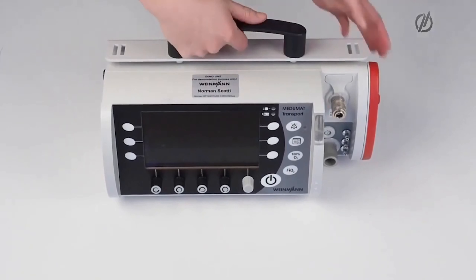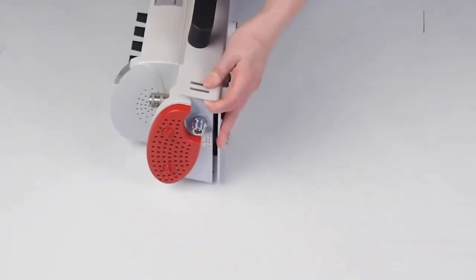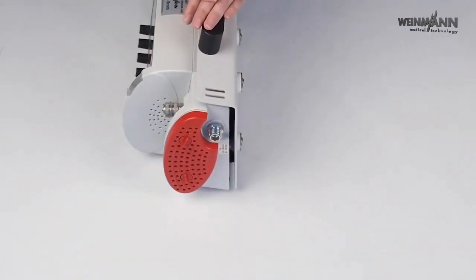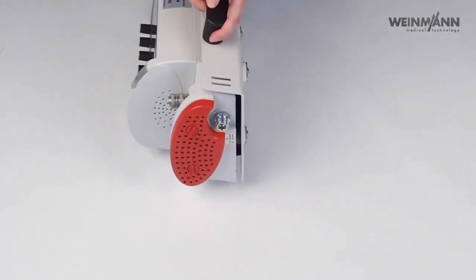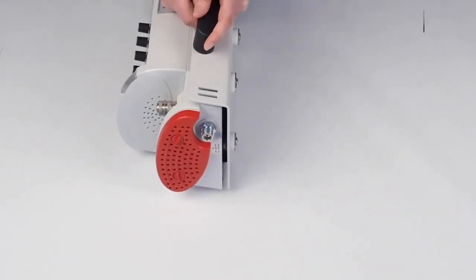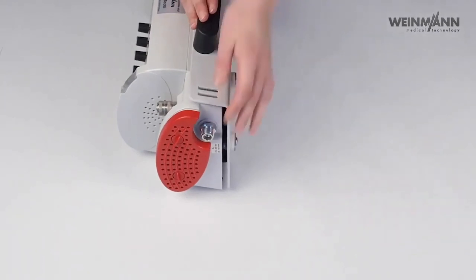On the left-hand side of the device we have the air intake. In this case we have the hygienic filter here, which is also optional for the minimum transport — it filters incoming air from viruses and bacteria. We also have our gas inlet; this is a pneumatically driven device.